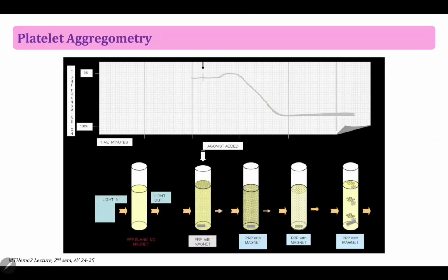So, platelet aggregometry, also known as the light transmission aggregation assay, has a similar principle with spectrophotometry, because both measure the optical density of your sample. Do you remember spectro? You still do spectro in your CC, right? Naturally, in platelet aggregometry, your platelets should be able to respond to the agonist added, because one of the functions of your platelets is to be able to clump with one another.